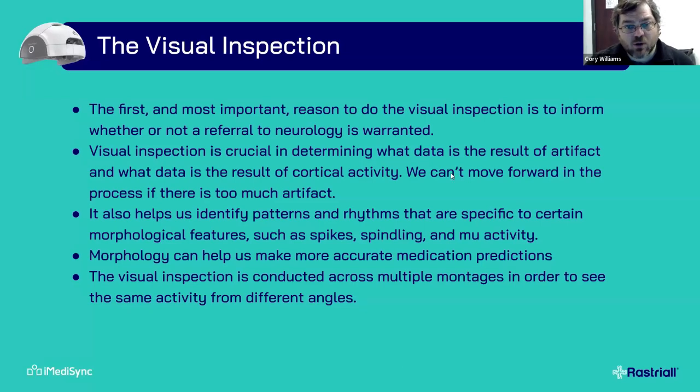The raw signal also helps us to cut out what's called artifact. So when you record an EEG, you'll get a lot of noise in your signal that is not from the brain. Things like eye blinks, things like muscle, and we don't want to map an eye blink or a muscle movement and interpret it as if it is real brain function.